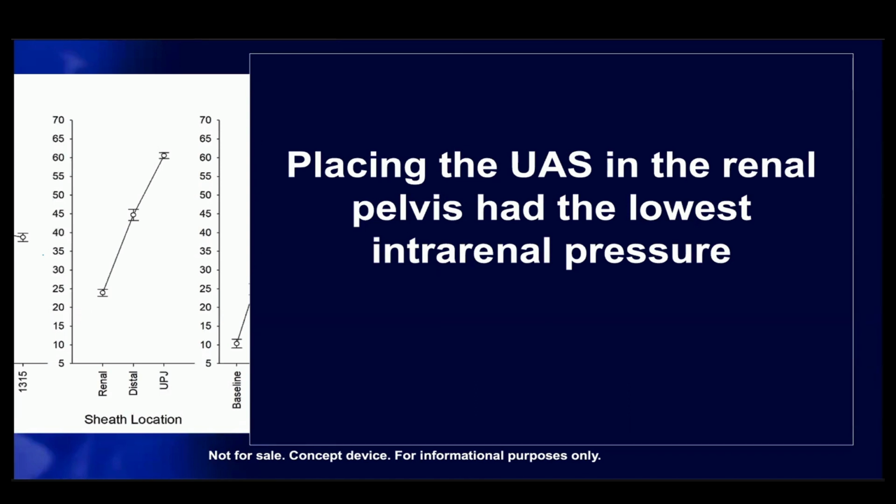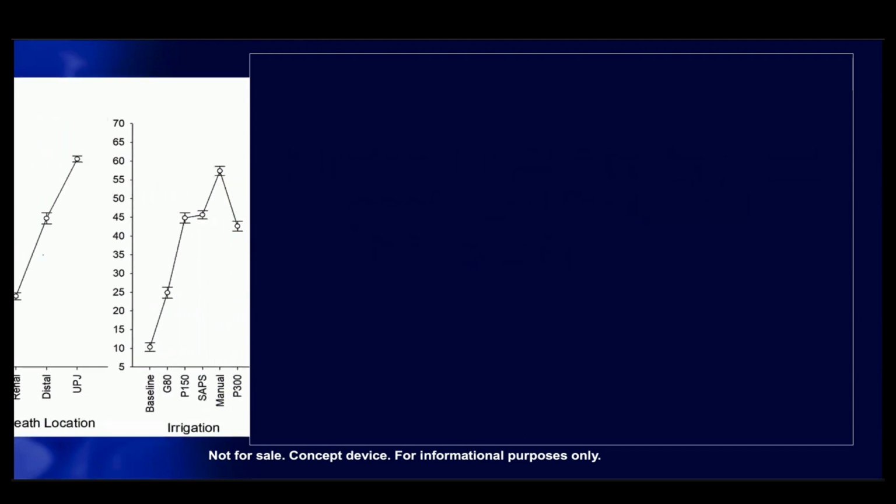Placing in the distal ureter, we actually have a theory about this, because the ureter above there is in communication with the scope. It gives it some opportunity to peristalse and get rid of some fluid around the scope. When you put the access sheath just below the UPJ, the ureter is unable to peristalse and may not be able to get rid of that pressure and that fluid.